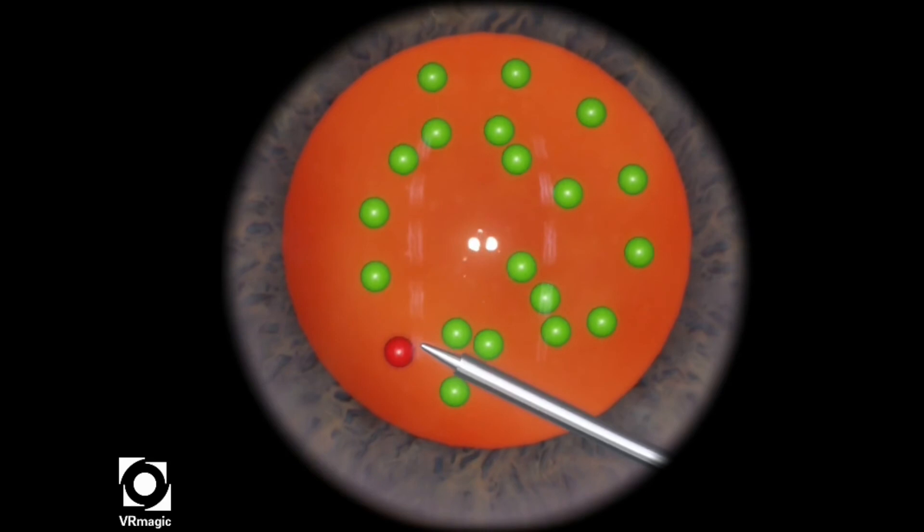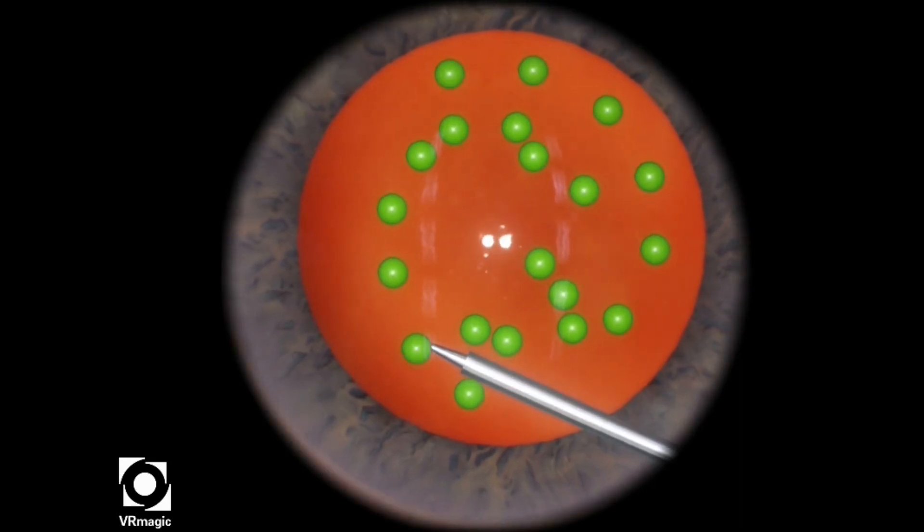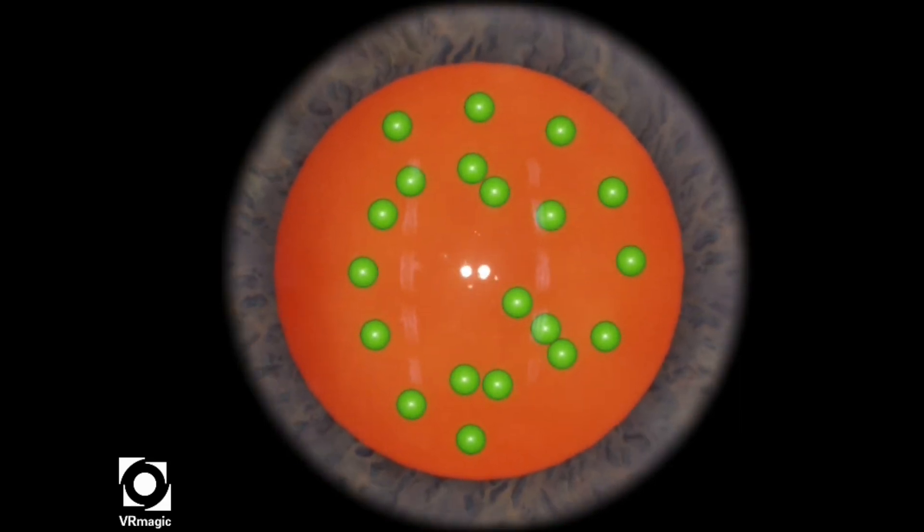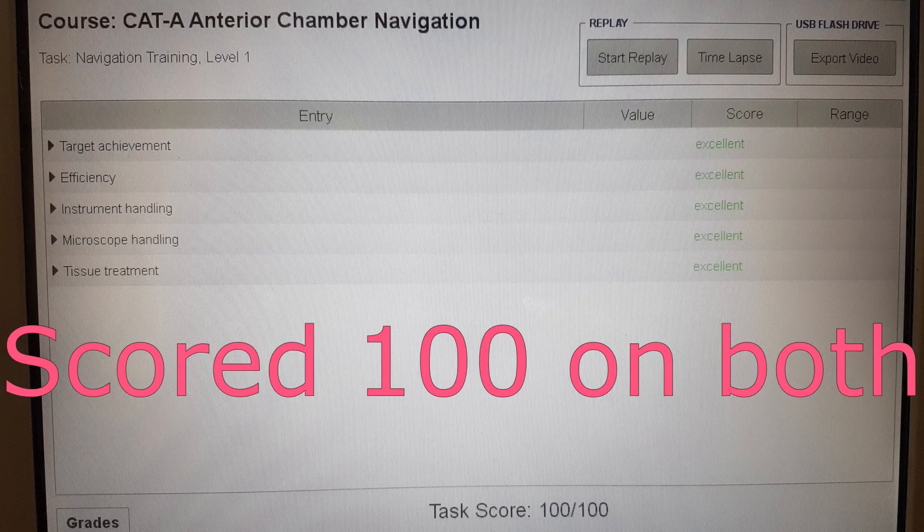And that's the last sphere. There we go. This spiral pattern is completely gone but I scored 100 on both tasks.